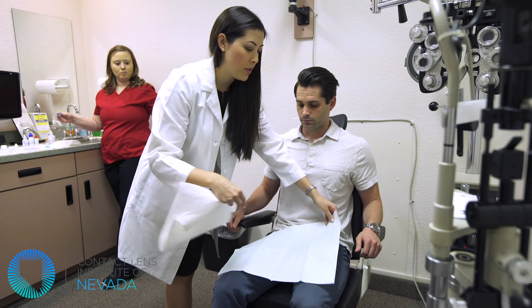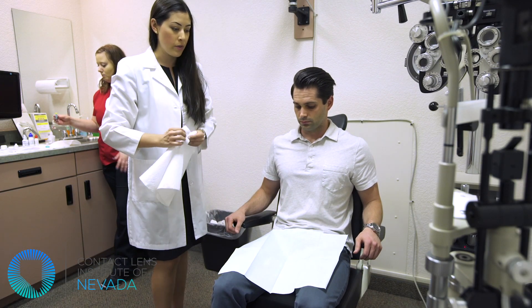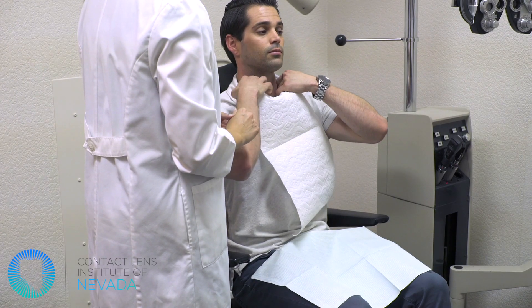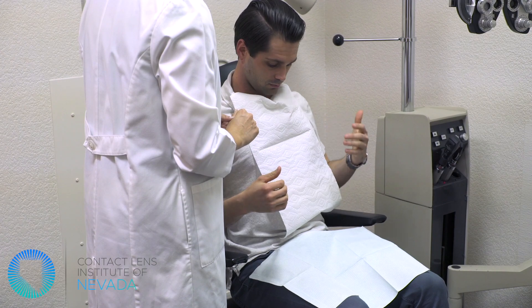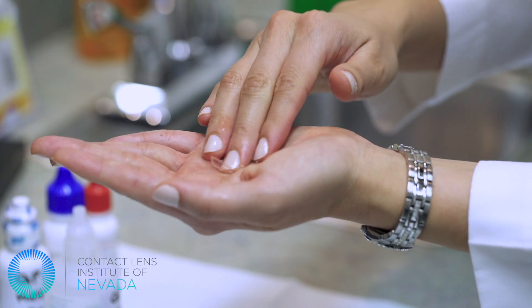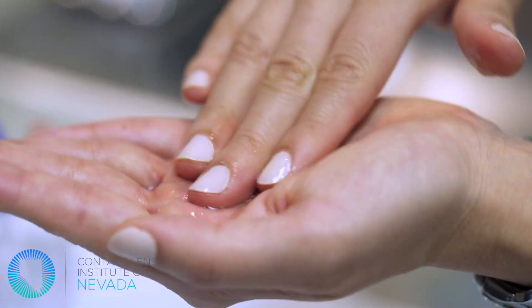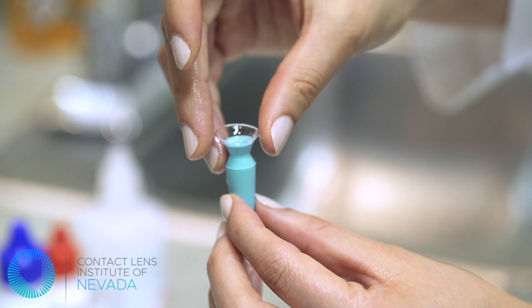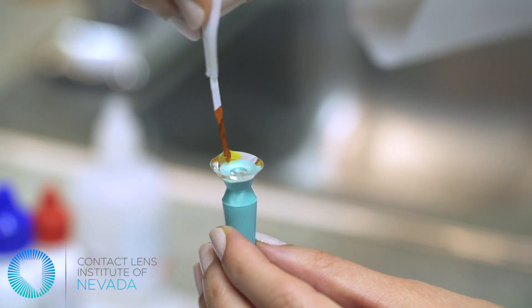The practitioner will begin by setting you up with some paper towels, an apron, or a dental bib to protect your clothing from the liquids and dyes used during the fitting process. They will then select a lens, clean it, and gently place it on your eye. The lens is filled with a non-preserved saline solution, and sometimes a yellow dye is placed in the bowl of the lens.